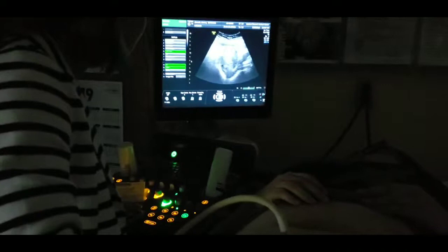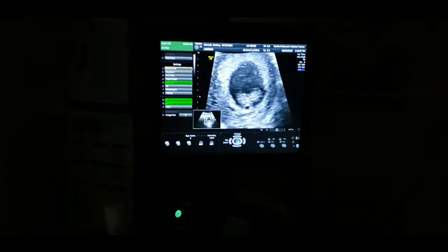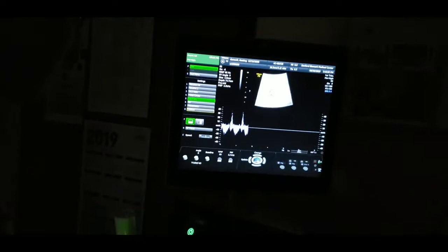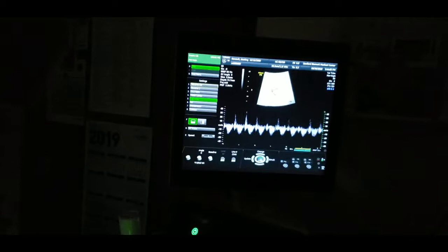You can sneak in there a little bit if you want to. I just think for mom to be able to see. So that little flicker right there is baby's heart. It starts out really fast.